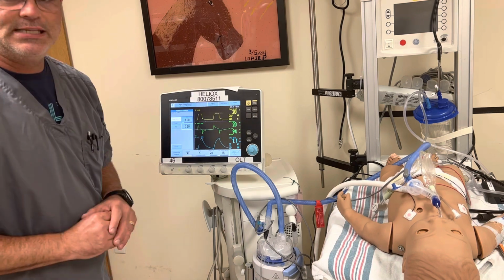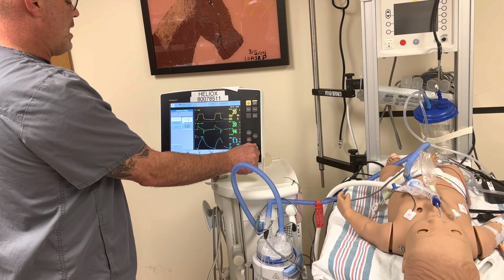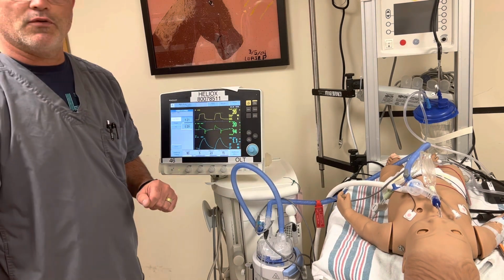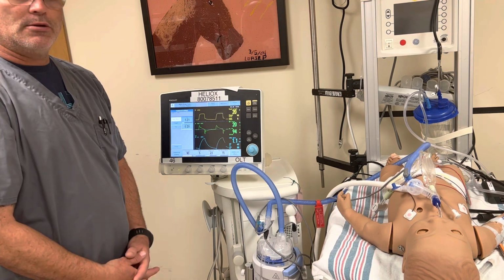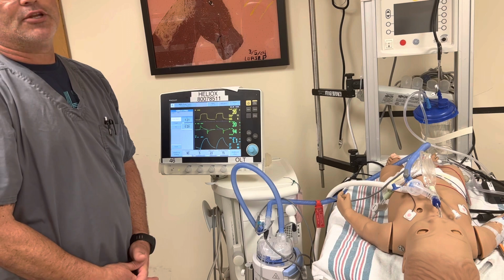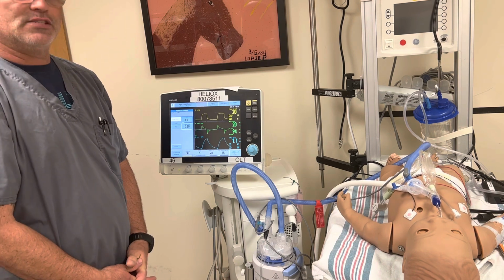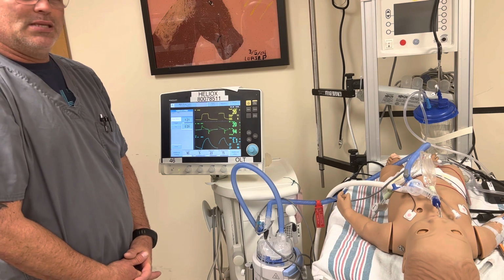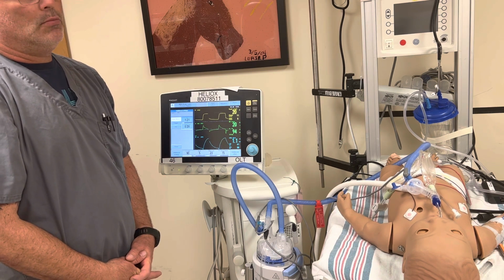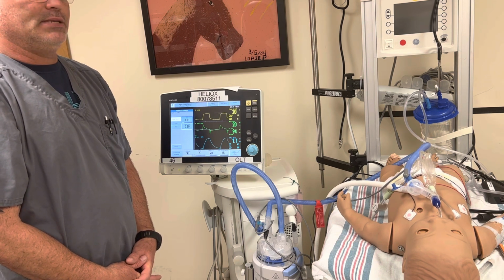Now let's say, for instance, this is a 1-year-old, and for whatever reason we have to go out to 1.2 seconds to get to zero flow on our waveform. What do we have to do as therapists? Well, we have to not do that. We have to set it at 1, and we have to notify the physician and call them to the bedside, because we need to have some direction. There's something that's not quite right, because a 1-year-old shouldn't, in most cases, need longer than a 1 second I time to get to zero flow.